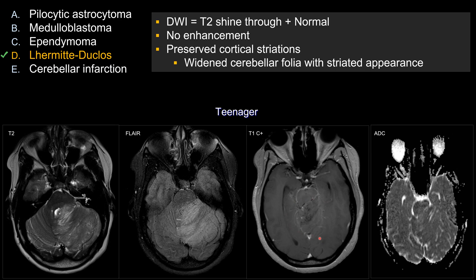On post-contrast sequence, you see no enhancing mass lesion — perhaps a slight increase in vascular enhancement, but otherwise no significant enhancement. On FLAIR and T2, you can see this dysplastic or disorganized appearance of clearly a mass lesion, yet there is preservation of cortical striation, which would be strange for other types of neoplasm. This would be a very classic appearance for Lhermitte-Duclos.